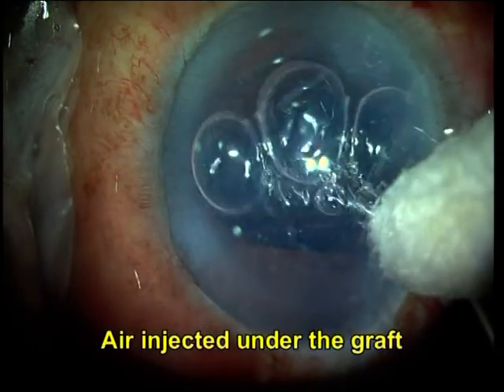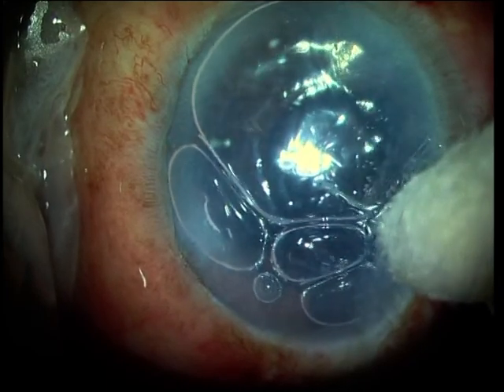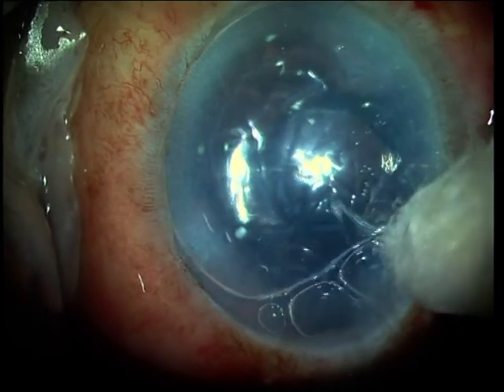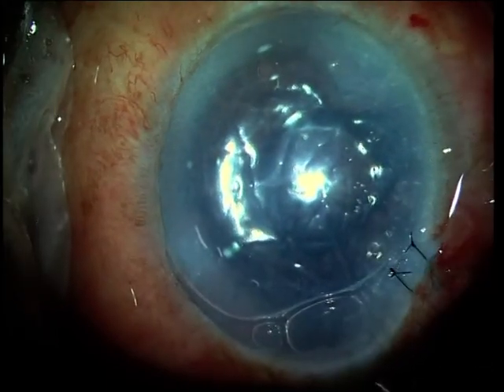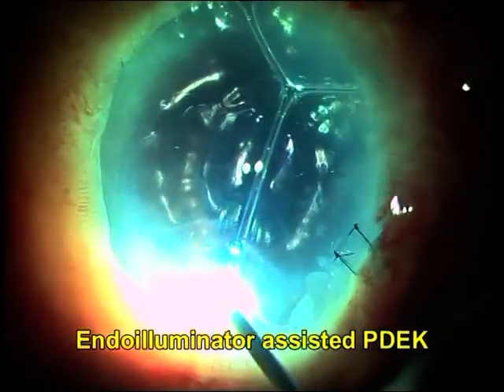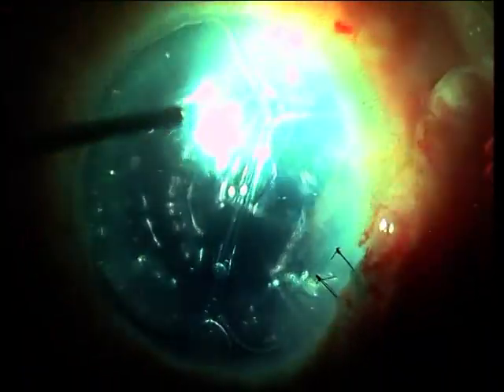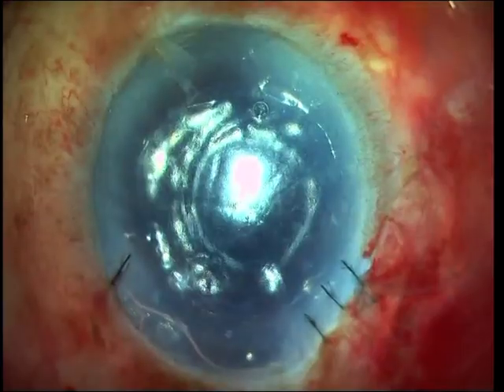Air is then injected into the anterior chamber for firm adhesion of the graft onto the Descemet's bed of the recipient cornea. A handheld endo illuminator offers better visualization, and graft attachment is ensured by examining the cornea with the handheld endo illuminator.